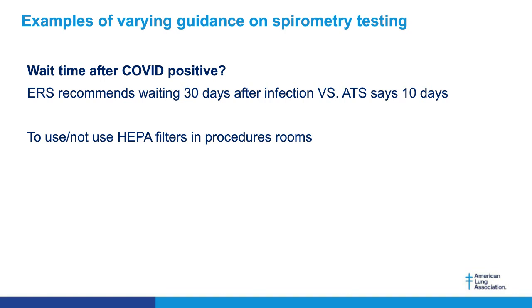Also, the use of HEPA filters or not. Big debate on that. European Respiratory Society says HEPA filters no. ATS says yes. And then our air exchange people say that adding a HEPA filter, although it's a scrubber, it scrubs the room, it makes the room cleaner, but doesn't decrease the air exchanges. And I'll talk more about that in a minute.